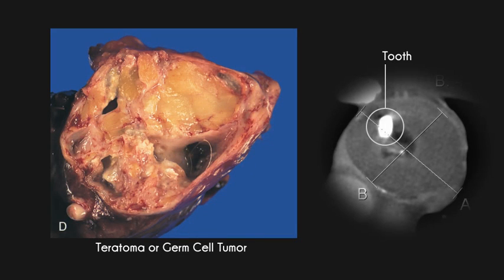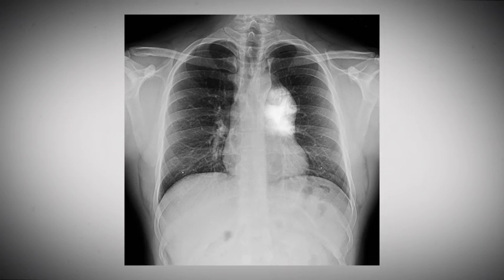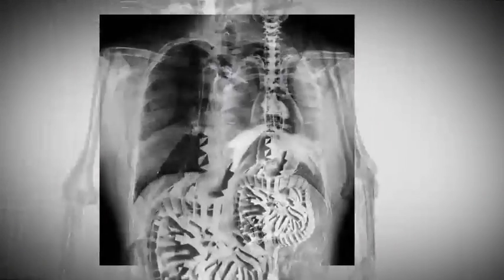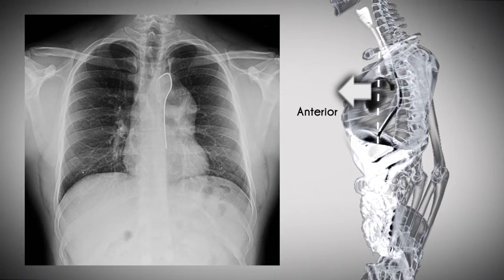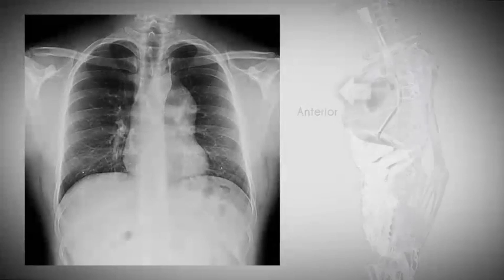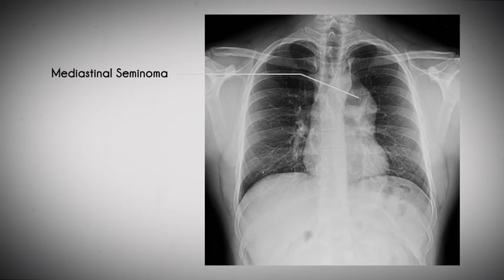The anterior mediastinum is the most common location for an intrathoracic teratoma. The second patient is a 25-year-old man with fatigue. The radiograph shows a lesion obliterating, or silhouetting out, the normal contour of the pulmonary outflow tract. Since the aortic knob is still visible, as well as a portion of the descending thoracic aorta, this mass is located in the anterior mediastinum, not in the posterior mediastinum. When looking at the cross-sectional CT imaging, the lesion is confirmed to be an anterior mediastinal mass. This is a mediastinal seminoma, which, like the teratoma, is a type of germ cell tumor.